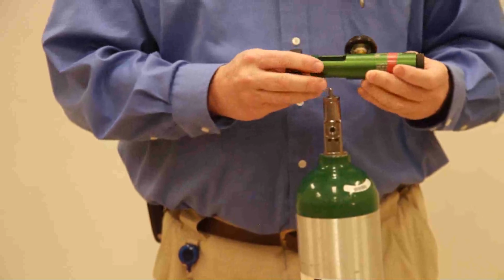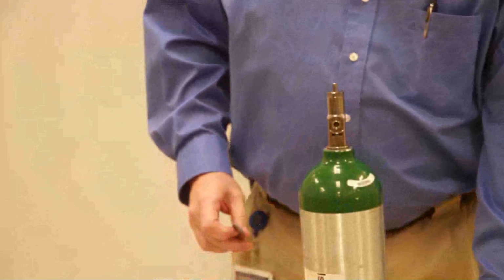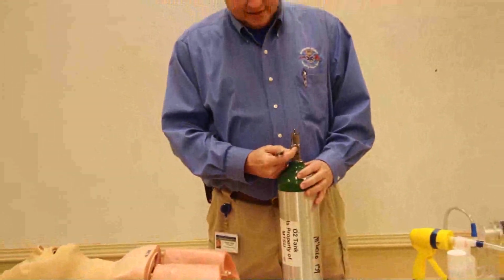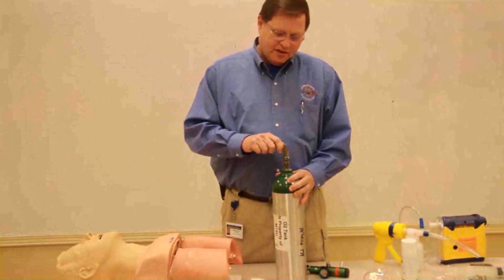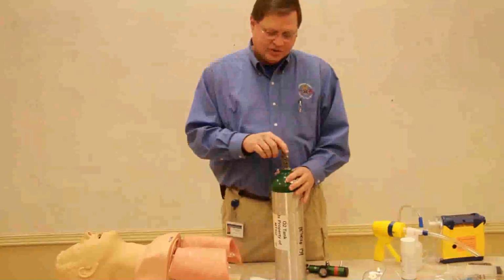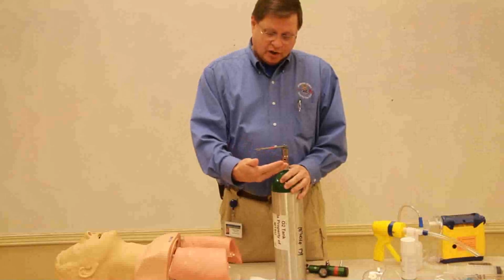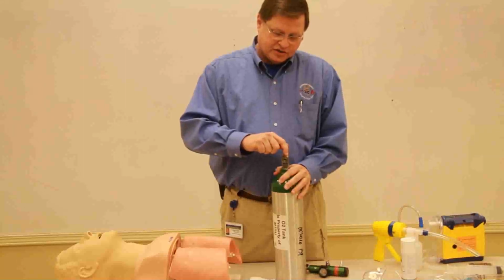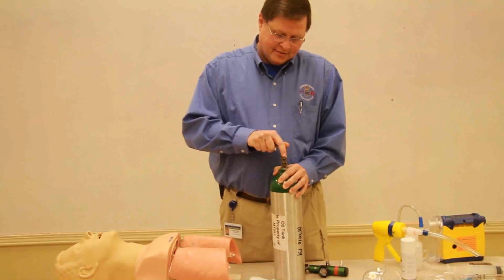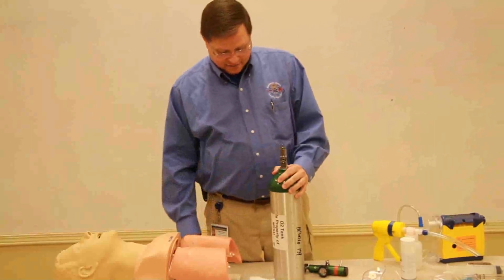Now, what we want to do is when we first get our oxygen tank, a lot of times we'll have little filings, minute micro filings inside, and we want to open the tank up just slightly so that we can blow these filings out and make sure that the tank is clean so we don't ruin our regulator with these oxygen tank filings. So we're going to do what we call crack the tank. And that's all it takes just to get those filings out of there.